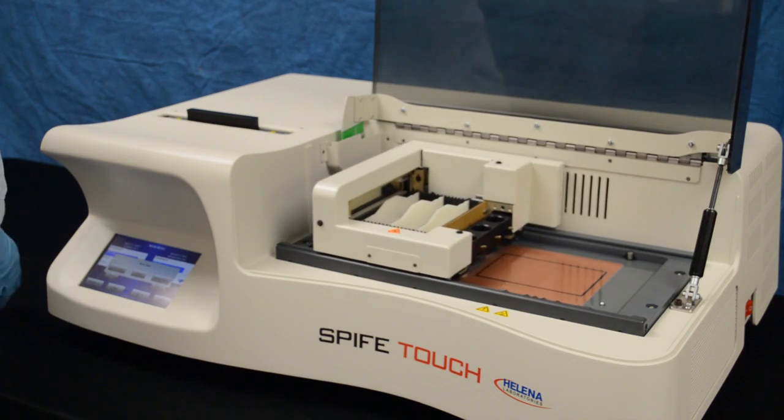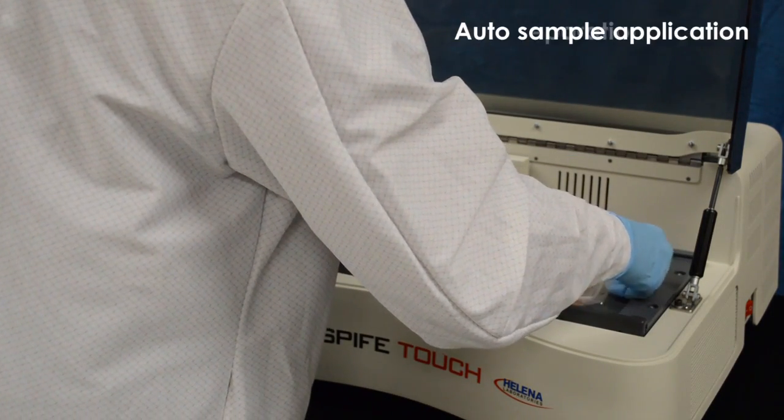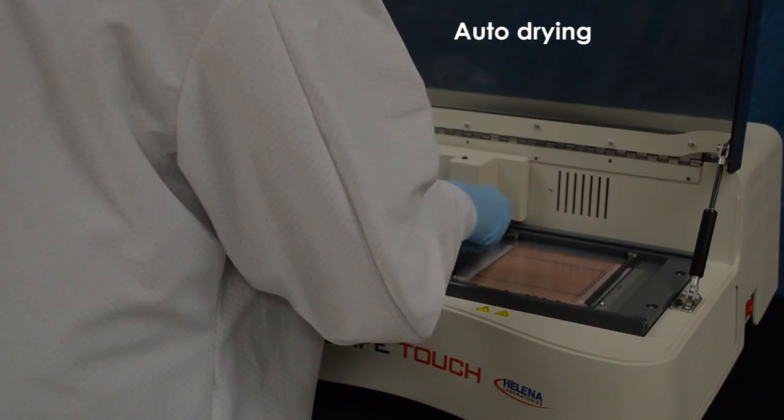Setting up and selecting tests is quick and intuitive. SPIFE Touch provides automated sample application, separation, staining, reagent application, and drying for all sizes of SPIFE agarose gels.